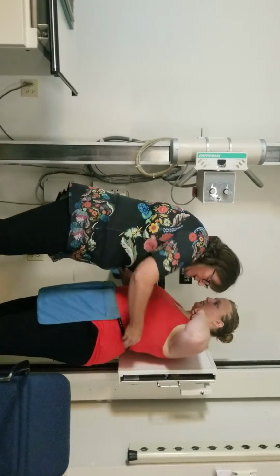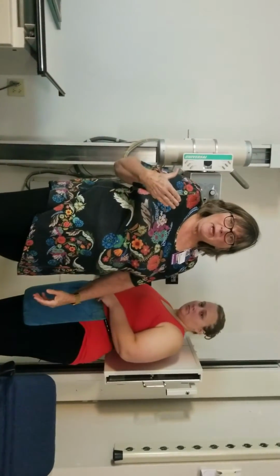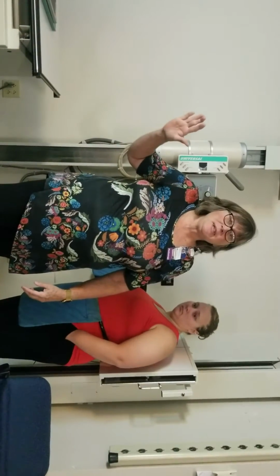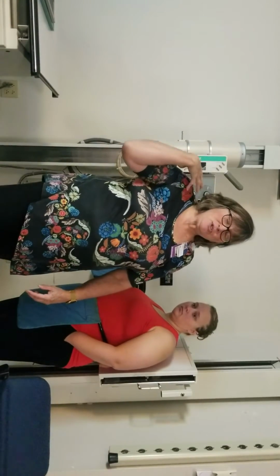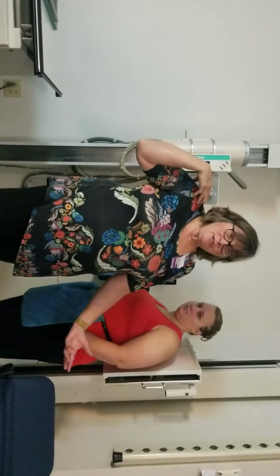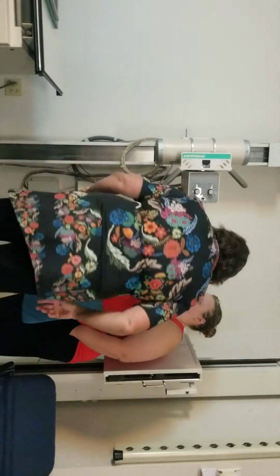We're going to do, if we can do these upright, that's preferred because it's less painful for our patient. If she came on a cart, I could do scapula, clavicles, AC joints on a cart, and we'll talk about that in class, or on the table, okay? But people with shoulder injuries, if they don't have to get up and down off of the table and they're steady on their feet, it's preferable to do them standing upright.